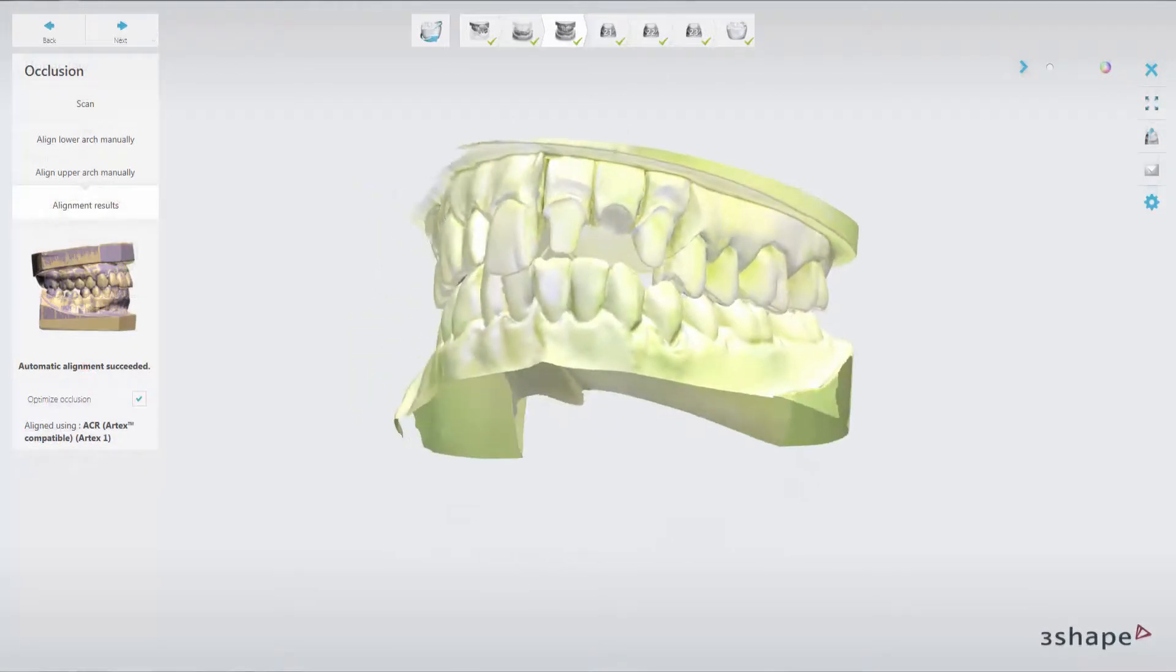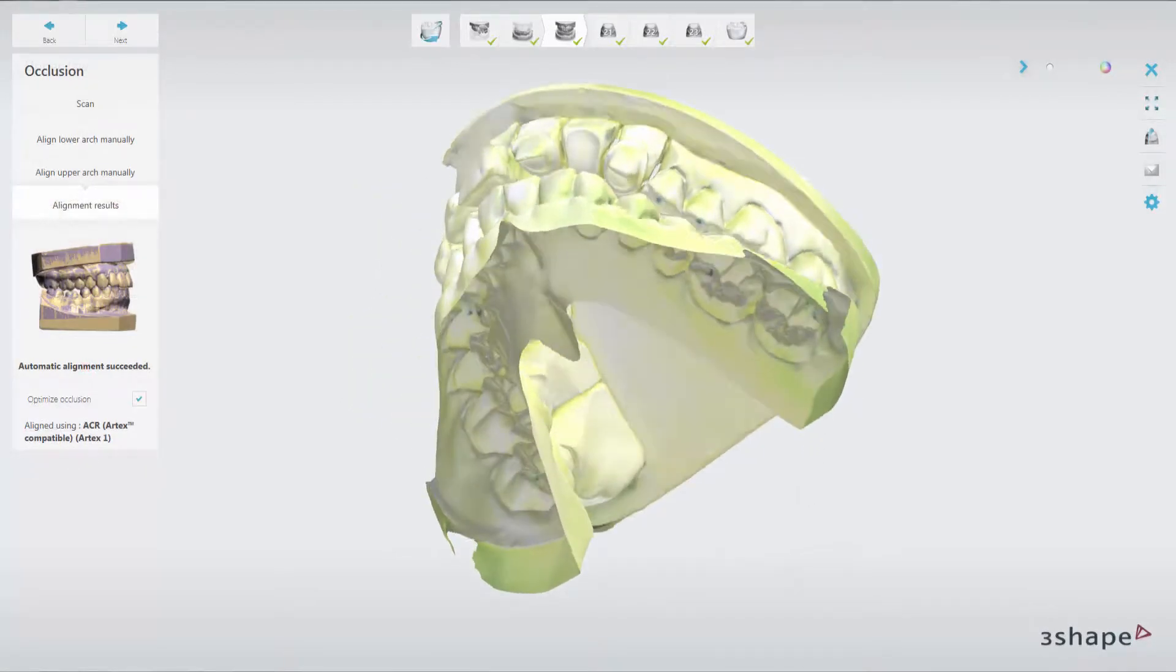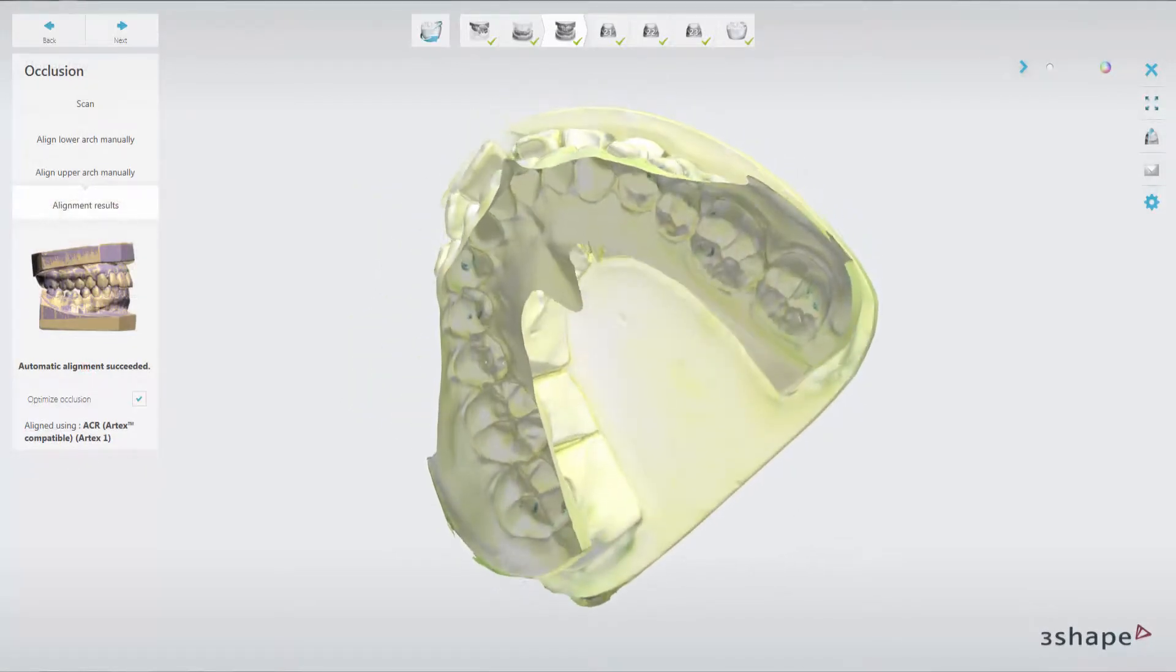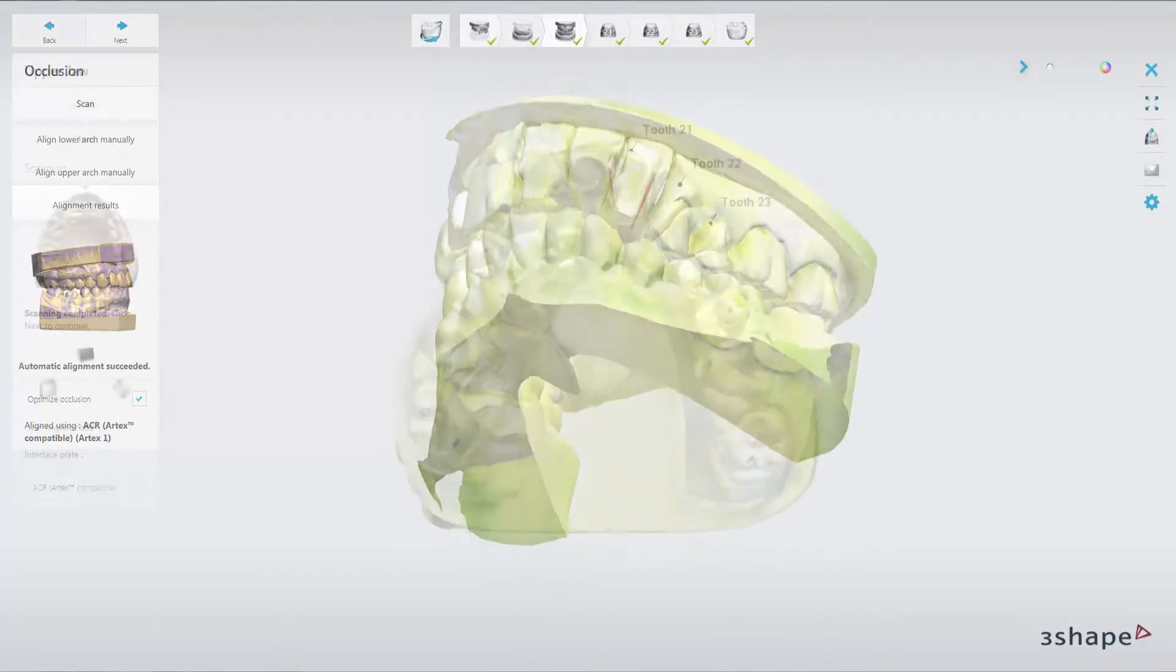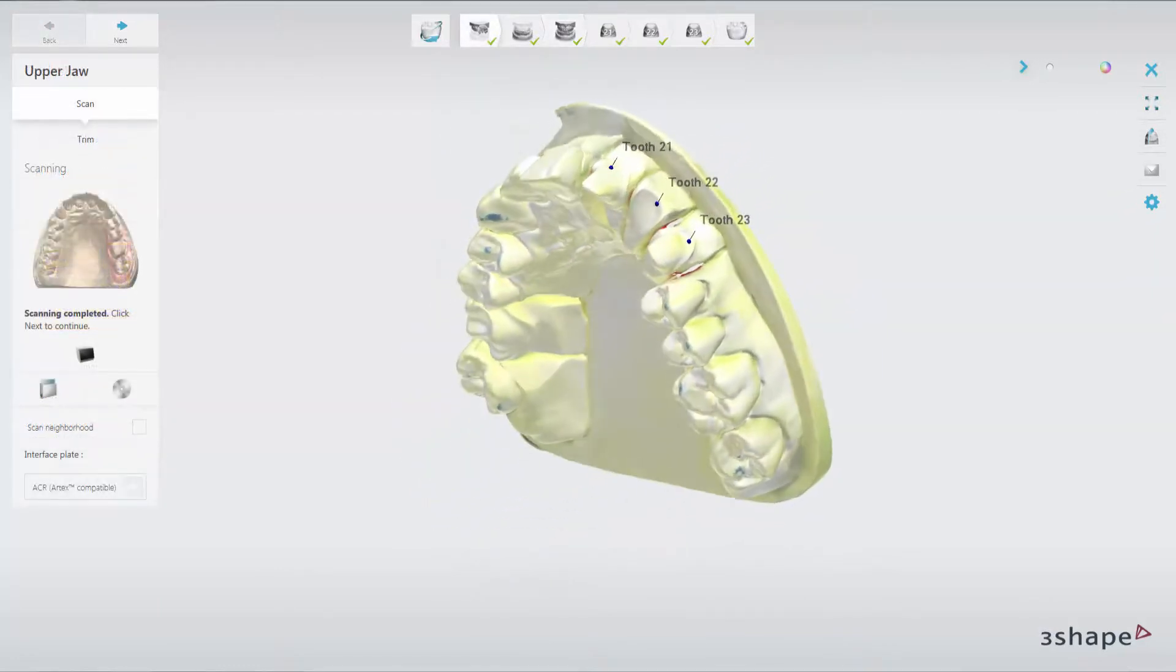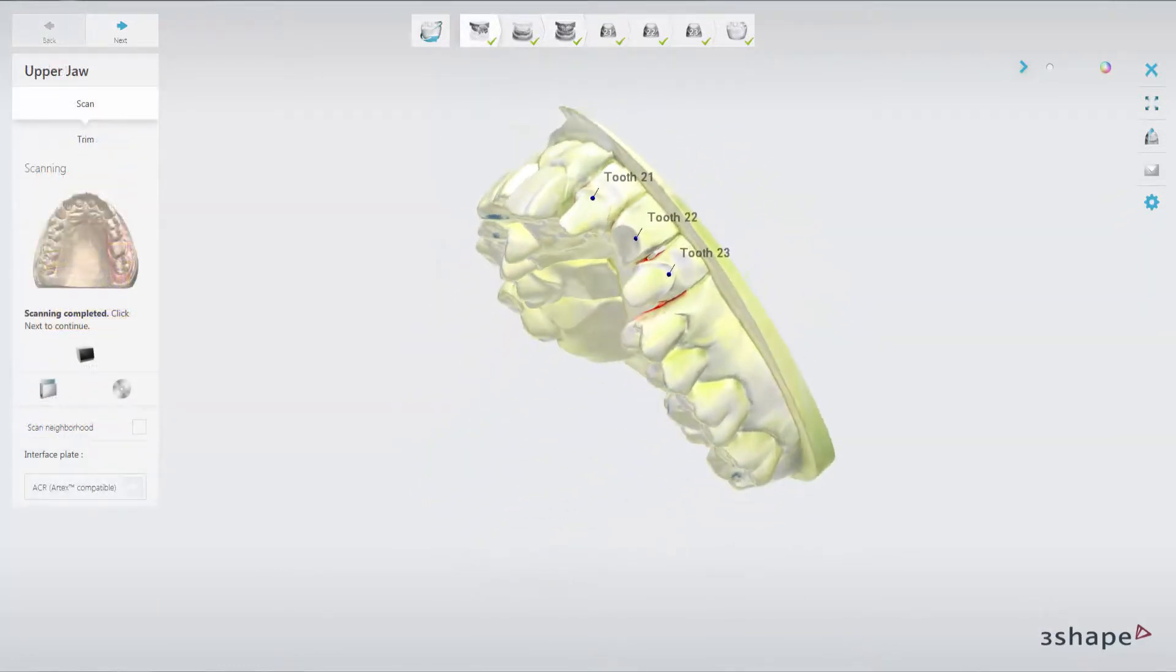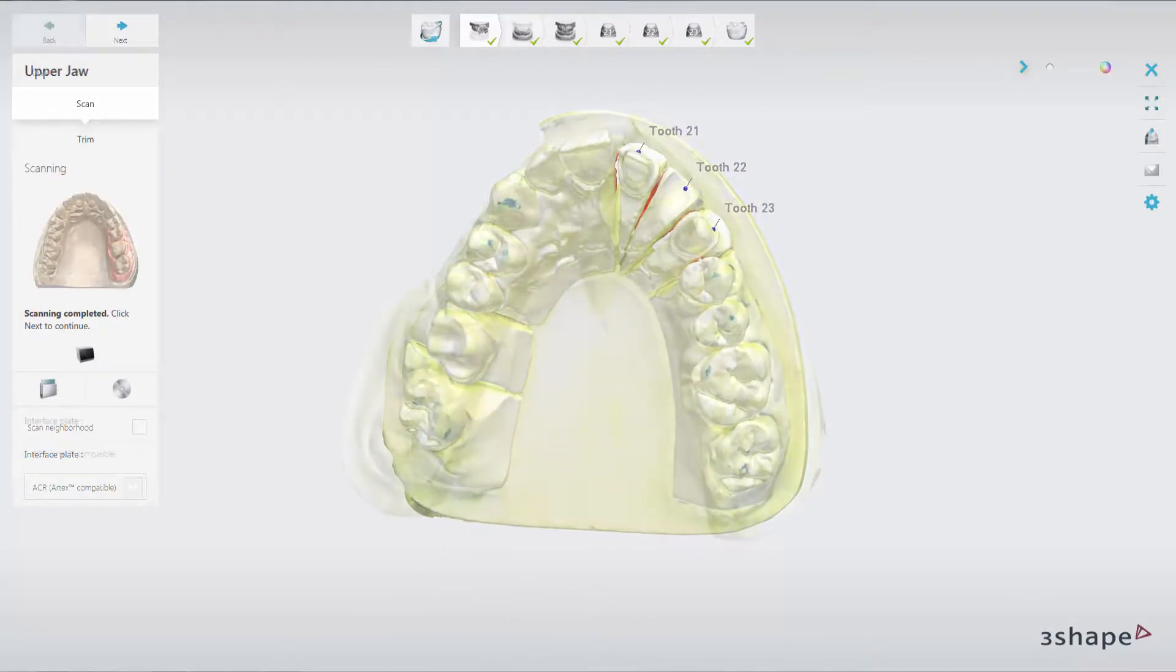Now the scans are ready, and due to the transfer of position from the physical articulator, the bite has been set automatically. There is no need for scanning dies if you scan dies in the Arch option.